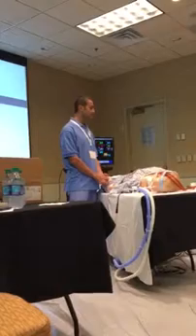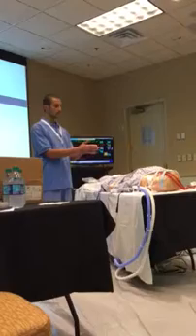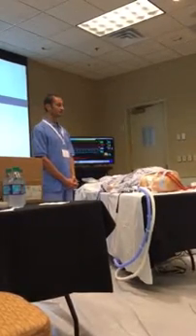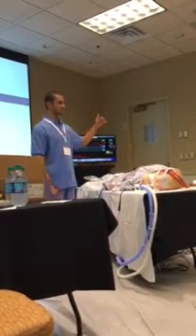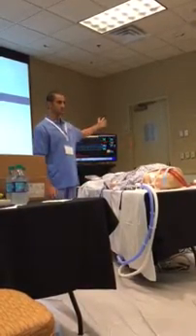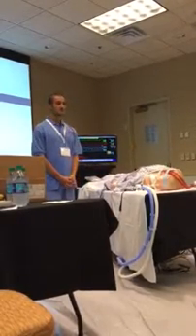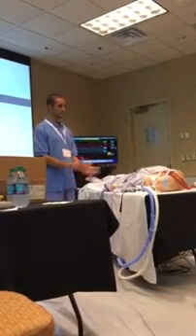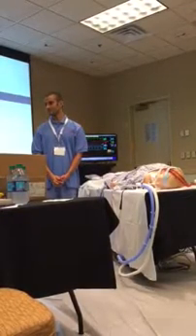The tank ran out. There's a patient we actually cannulated at a different hospital, and as soon as we went on ECMO, the first thing you look for, of course, is that color change. We didn't get the color change, and we were trying to figure out why. And the wall oxygen wasn't functioning. This is an academic hospital, in their ICU, and somehow that wasn't working. So it could be anywhere from the oxygenator and back. So that's the first thing to do, ask for that color change, because it can help you with your differential. We'll discuss the other parts of that afterwards, because we'll get into some of those other scenarios. I don't need to give things away.